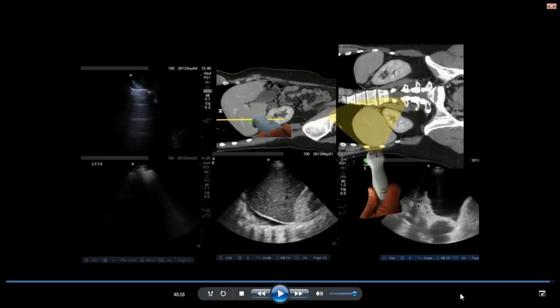I'm not specifically talking about mesothelioma only, and I would encourage you to look up the resources that Mike just mentioned, but at the bedside, when you're doing binary decision making, just the appearance of the pleura itself, whether it's smooth or not, can give you a lot of information.